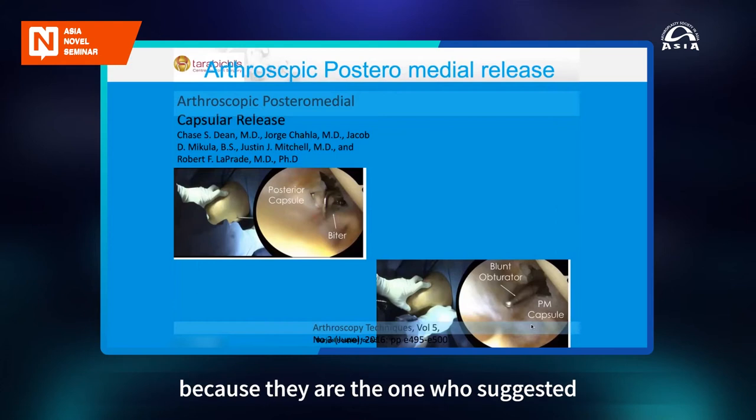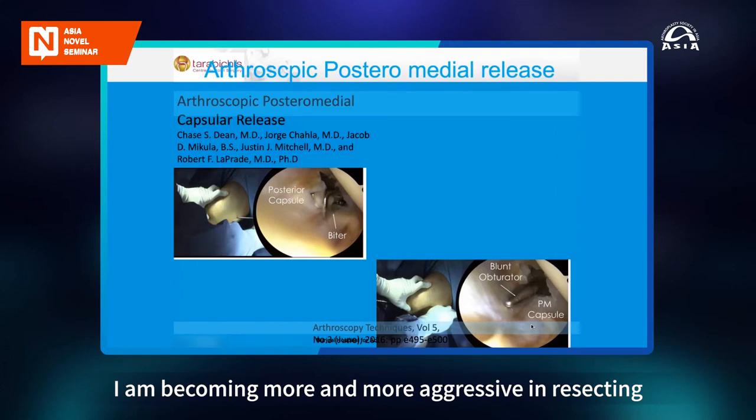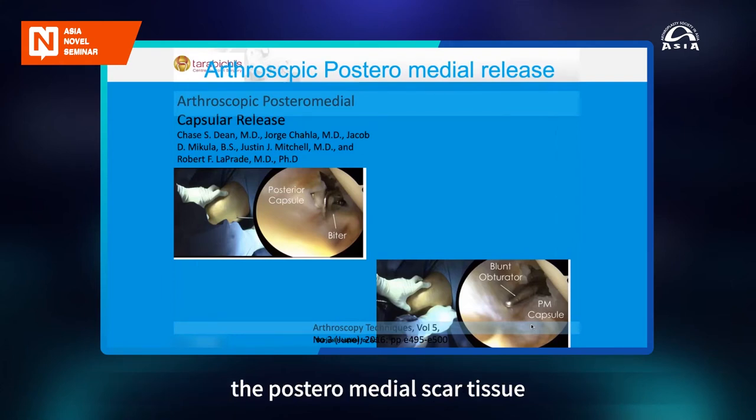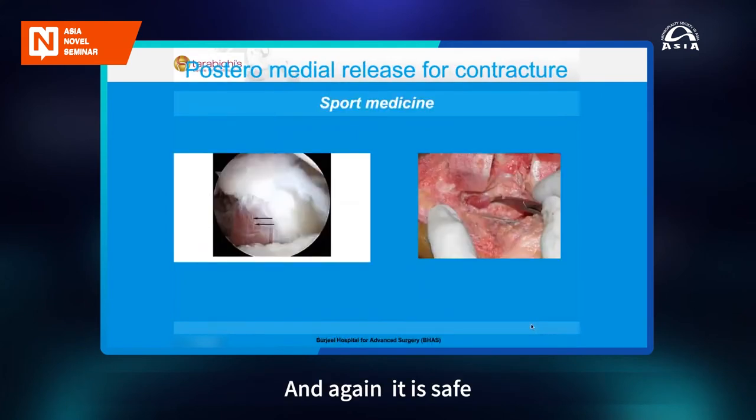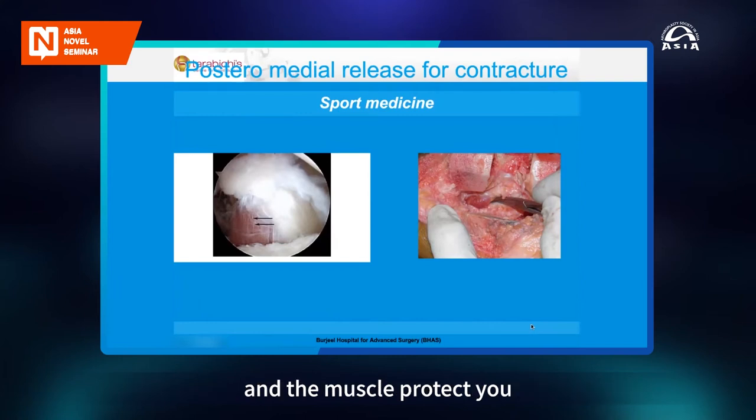And I have to remind, and kind of give credit to the sports surgeons, because they are the ones who suggested, in flexion contracture, doing an excision of the posterior capsule. And this is a paper that describes it. So that's why I am becoming more and more aggressive in resecting the posteromedial scar tissue. And again, it is safe. Similar to what the sports surgeons do, the way they do it. You could see that they sometimes reach the muscle, and the muscle protects you.